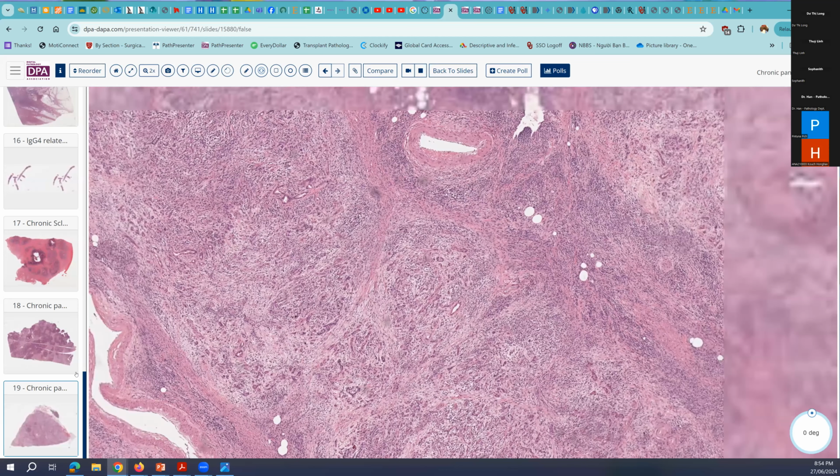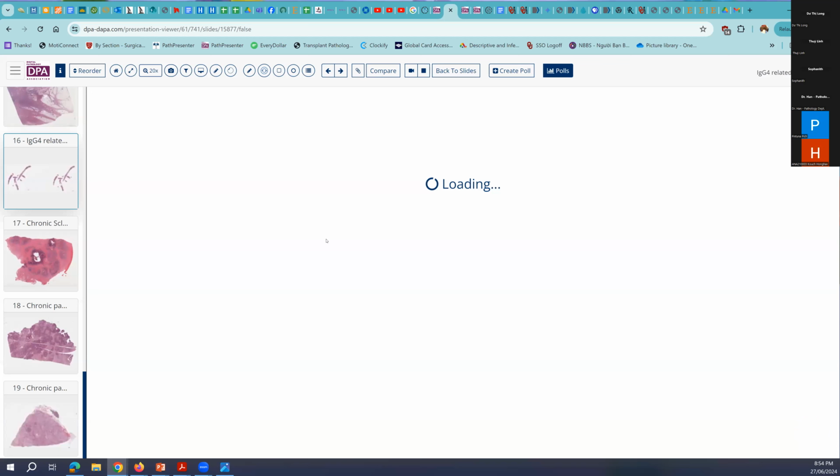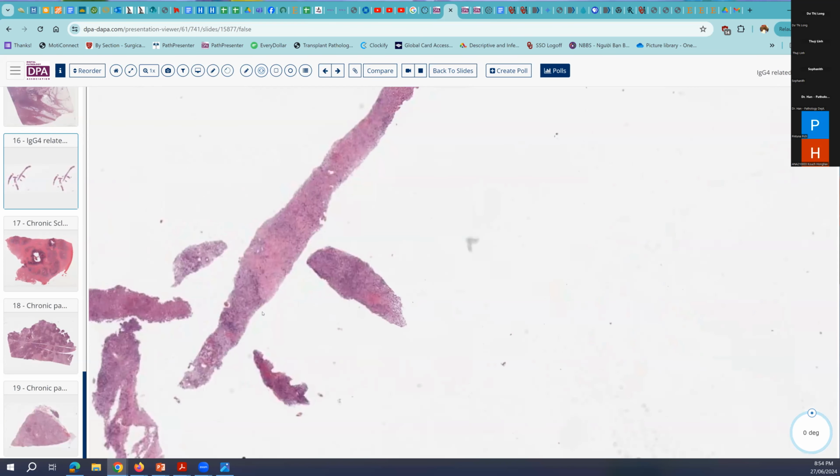Well, we're just about through with the hour. I think I'll sort of pause here. Well, actually, let me show you one more case of this, because this can also involve the liver and the biliary ducts, extrahepatic and intrahepatic. So here actually is a liver biopsy in a patient with kind of biliary obstruction.